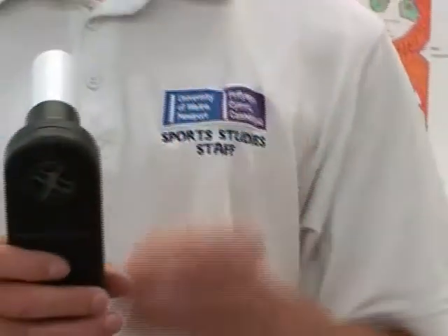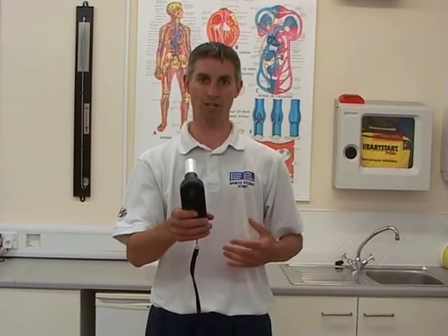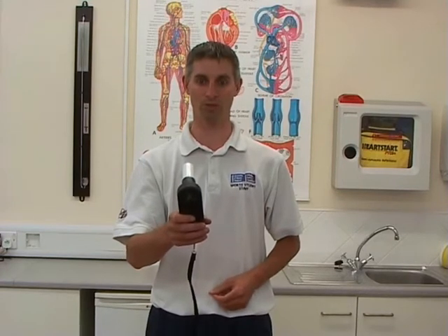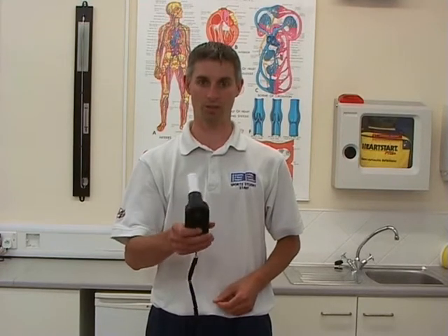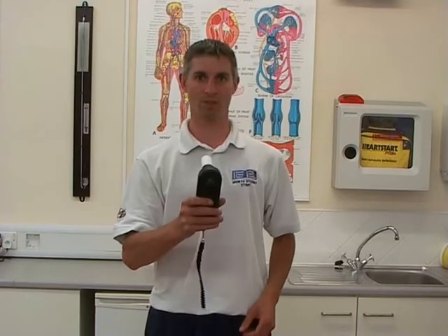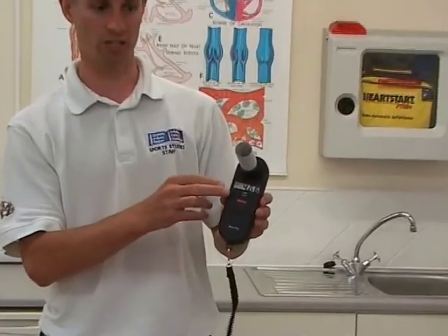Standing upright, head facing forward. The operator takes a deep breath in and then is going to exhale as hard as possible for as long as possible. Deep breath in. And there will be a beep when the device is finished collecting data.